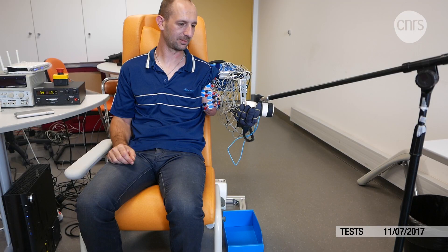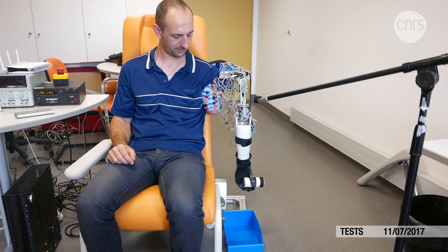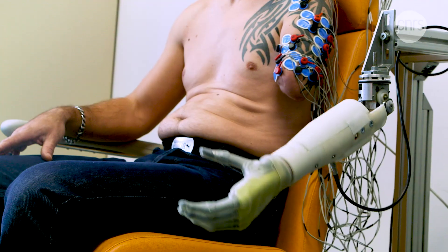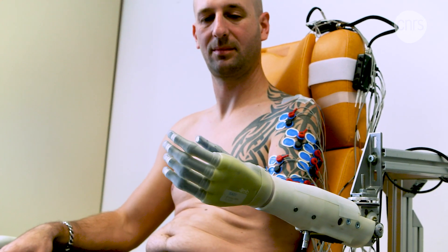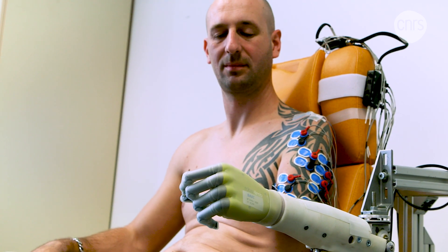On top of enabling a more natural form of prosthetic control, these tests are creating a new, constructive outlook on the idea of the phantom limb, which until now was simply considered a psychological side effect. This removes a taboo. Often the response a patient would receive when talking about their mobility was, 'you can't move something that isn't there,' and the patients would worry that they were strange. This, I hope, will change with our study. These promising early results have encouraged the team to continue their exploration of the phantom limb — their study could one day enable amputees to control their prosthetics as naturally as their own arms.